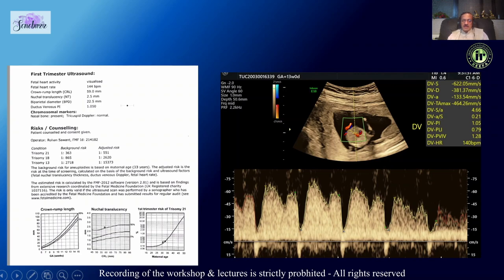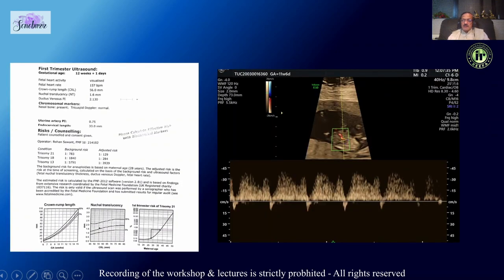For example, here the adjusted risk with DV is normal. This is an artifact — this is not a reversal. The A-wave is here, whereas here we see a true reversal of the A-wave.